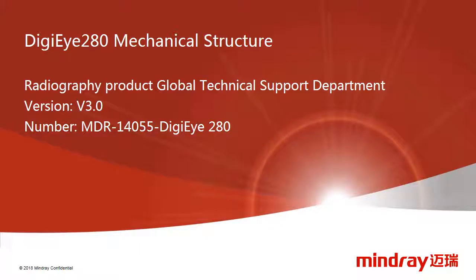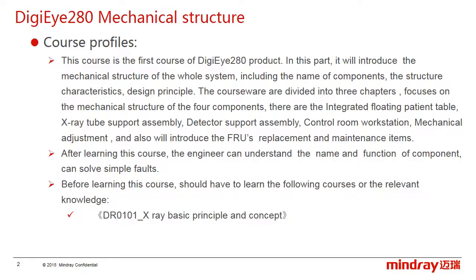This course is about the mechanical structure for DigiEye280. It is the first course of DigiEye280 products.